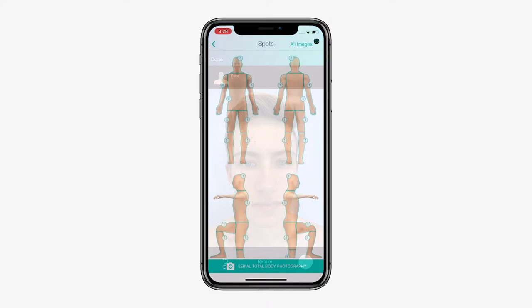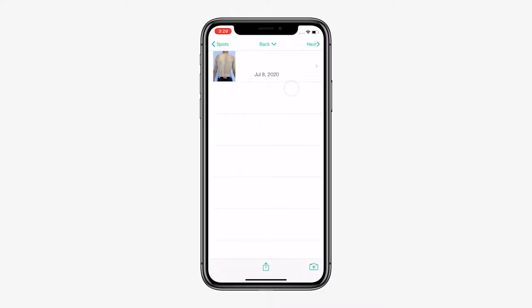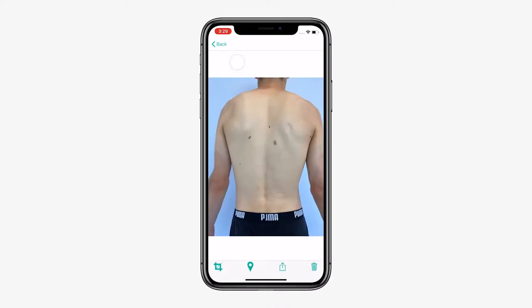Once you've completed total body imaging, you can then add corresponding dermoscopic images easily. Go to your desired body part, then select the TBP image you would like to start mapping. Then press detect lesions and select the lesions of concern.